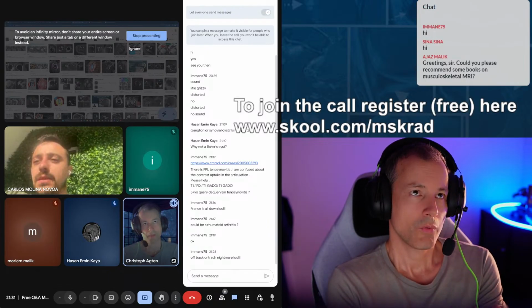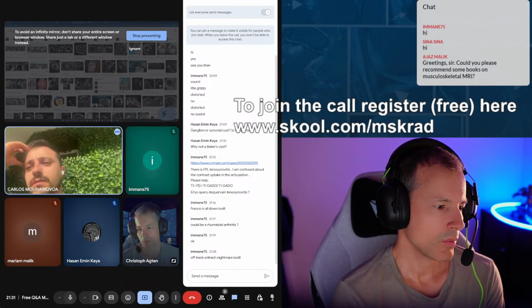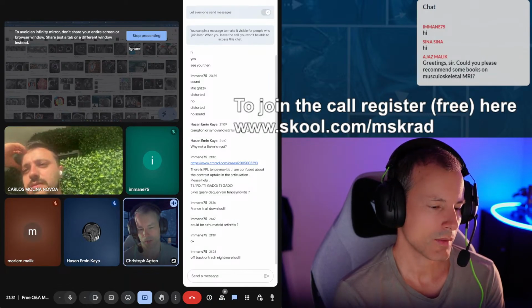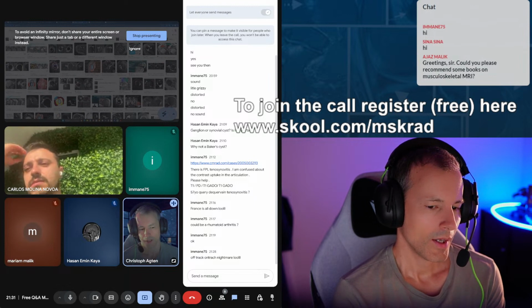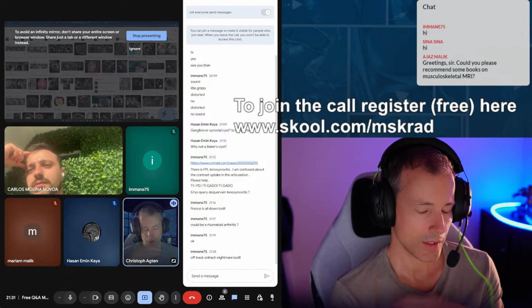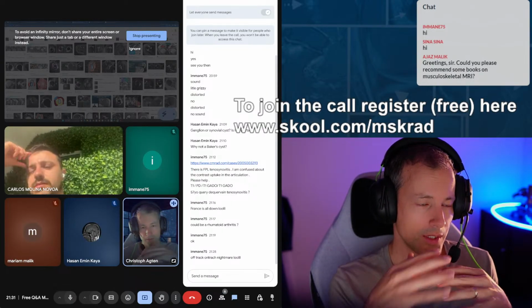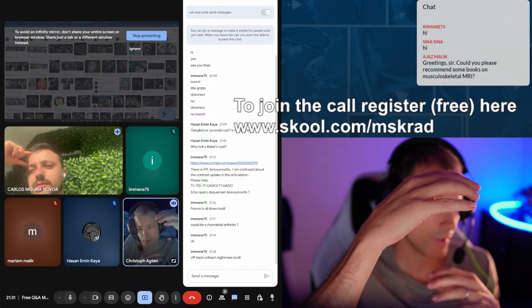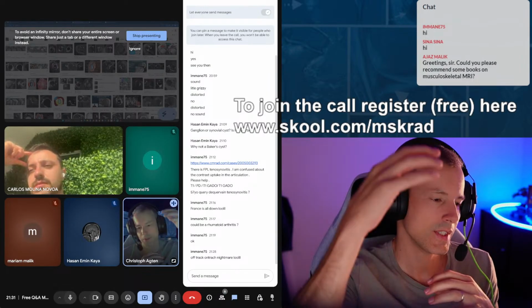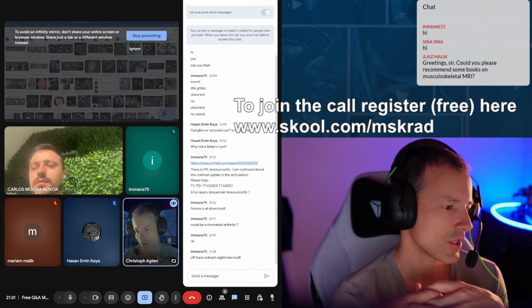No, I think so. I use the muscle as an internal reference. To call osteomyelitis, the marrow should be the same as muscle or lower. We often see foci of osteomyelitis where we can see the dark marrow in T1, which is osteomyelitis, and then we still see the edema go beyond that focus. And everywhere where you see edema, you will have enhancement. So the enhancement alone will not prove that this is actually osteomyelitis.